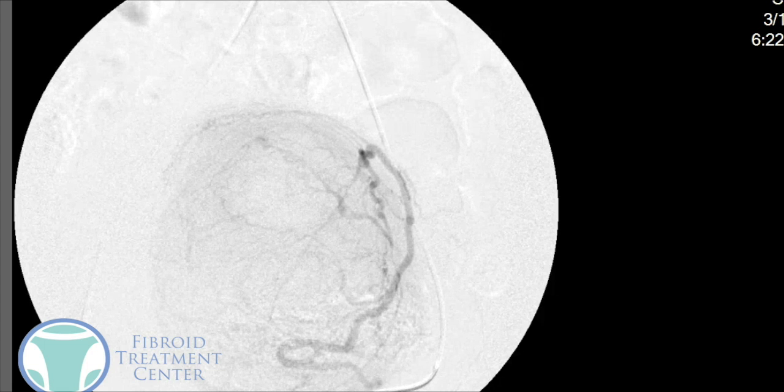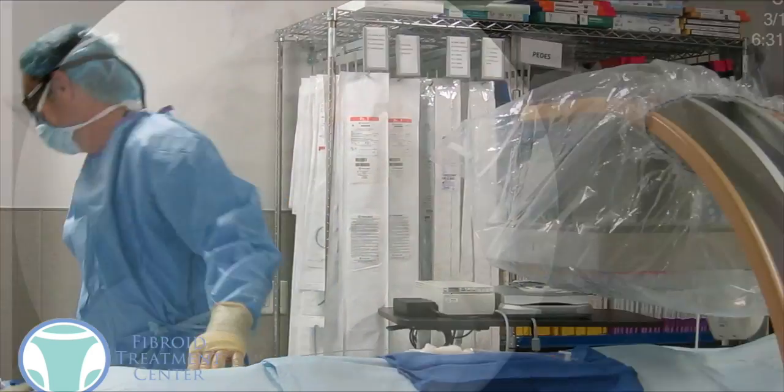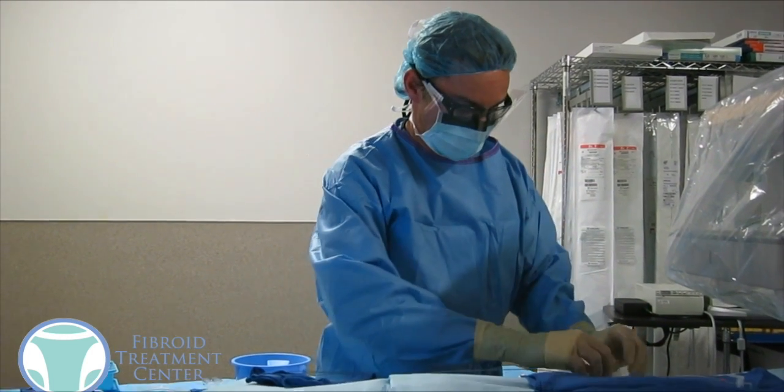We know we're in the correct position at this point. We're going to take the catheter and inject some little microscopic particles into the fibroid and into the artery to close off the blood flow. Once we've flushed the catheter, we'll do another x-ray, and as you can see there, the dye is no longer going into the uterine artery and the fibroid arteries — there's no more flow. It's actually going to go backwards up the catheter and then down into the normal arteries in the left side of the pelvis. We know we did a complete embolization on the left side.